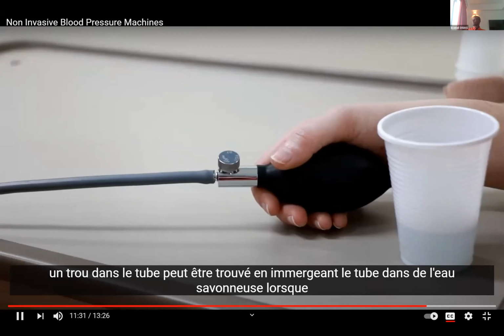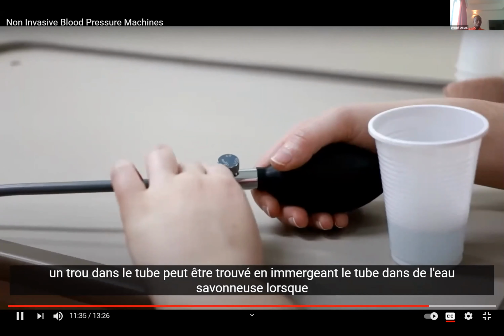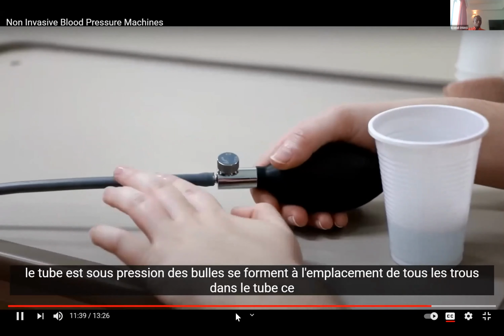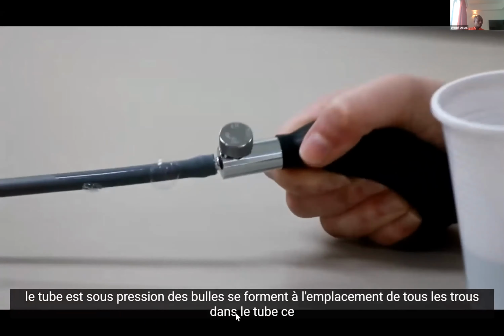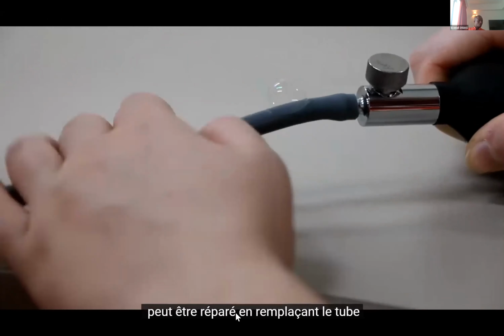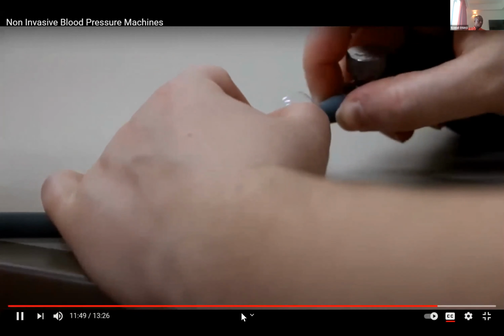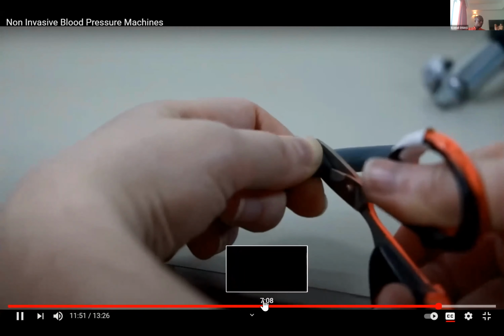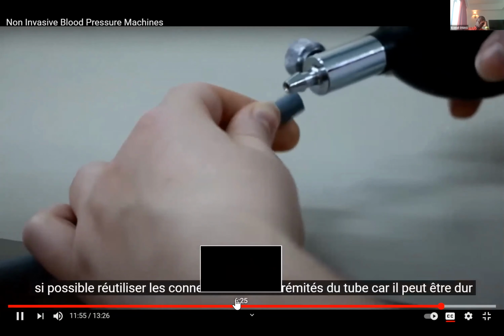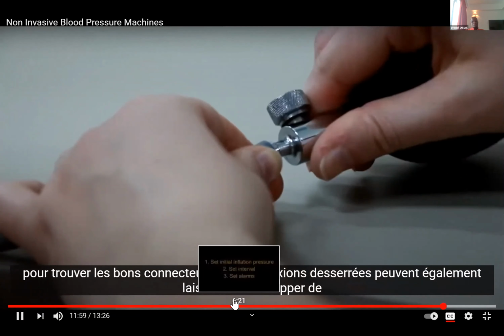A hole in the tubing can be found by submerging the tube in soapy water. When the tube is pressurized, bubbles form at the site of any holes in the tube. This can be fixed by replacing the tubing. If possible, reuse the connectors at the ends of the tubing since it can be hard to find the right connectors.